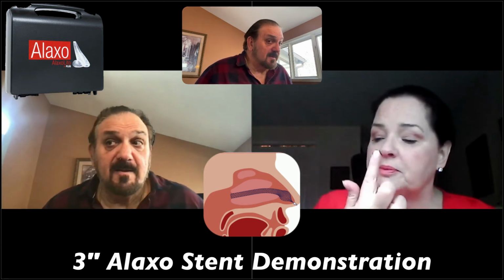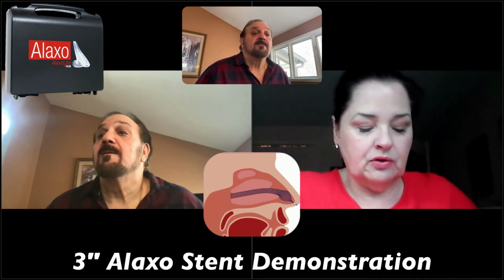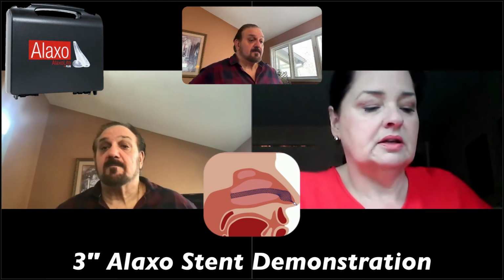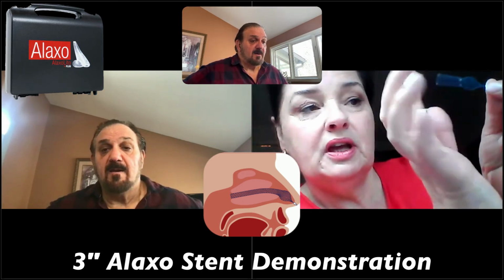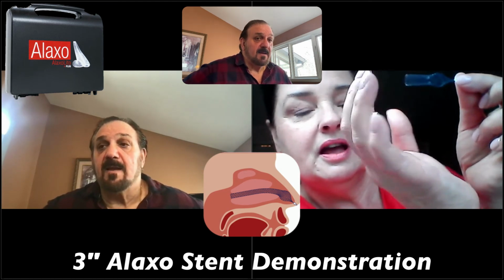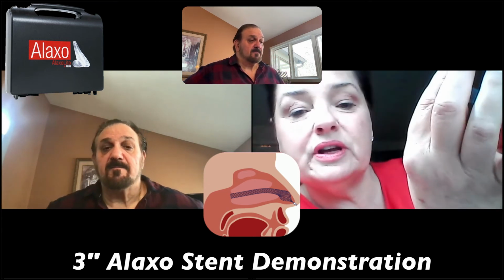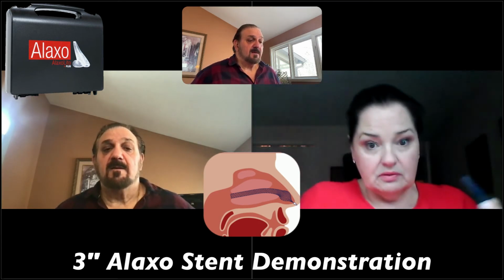Because you don't want to be pushing it back, because once the stent is inside of your nose, right? Once it's inside and this is the end sticking out, if it's inside and you push, it's going to do that. Yes, no, I got it. And it's also against the grain. There is a grain to this stent. This way is smooth. This way is like a cheese grater. So that's another reason not to do that.